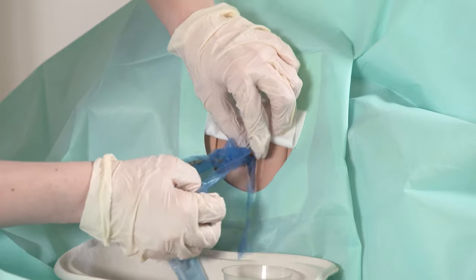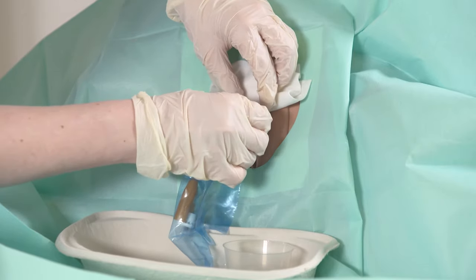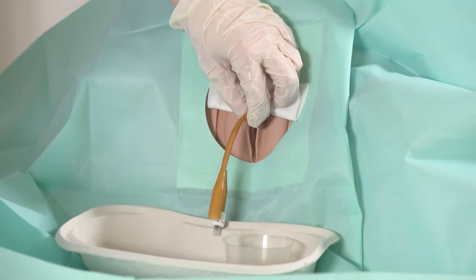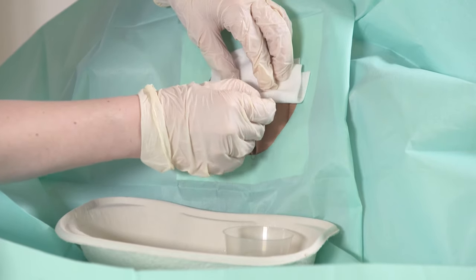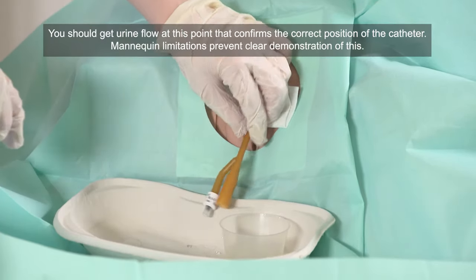Then you should start to see some urine flowing. We should get urine into the pot.